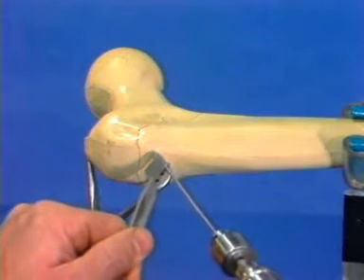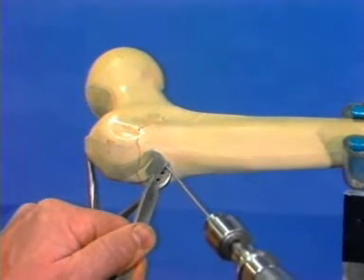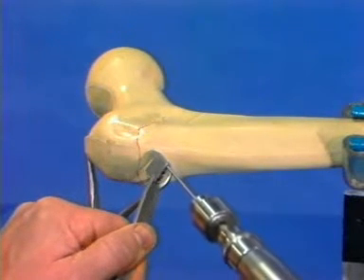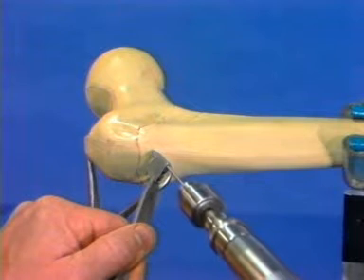We now provisionally fix the fracture with Kirchner wires. These must be placed superiorly in the head so as not to interfere with later guide wire placement.